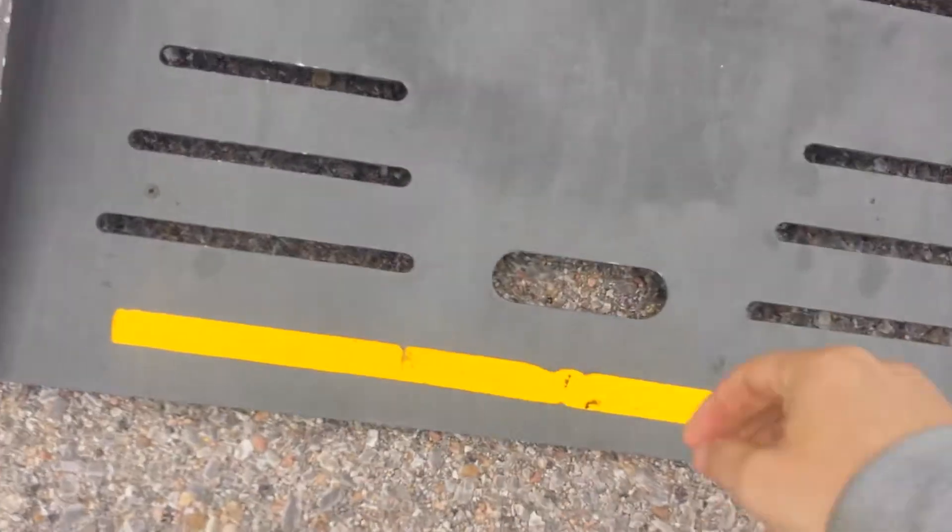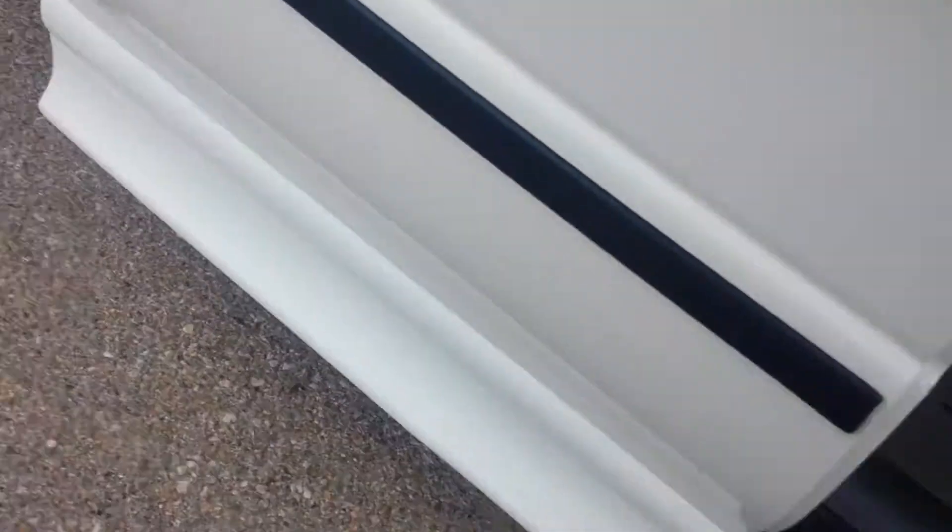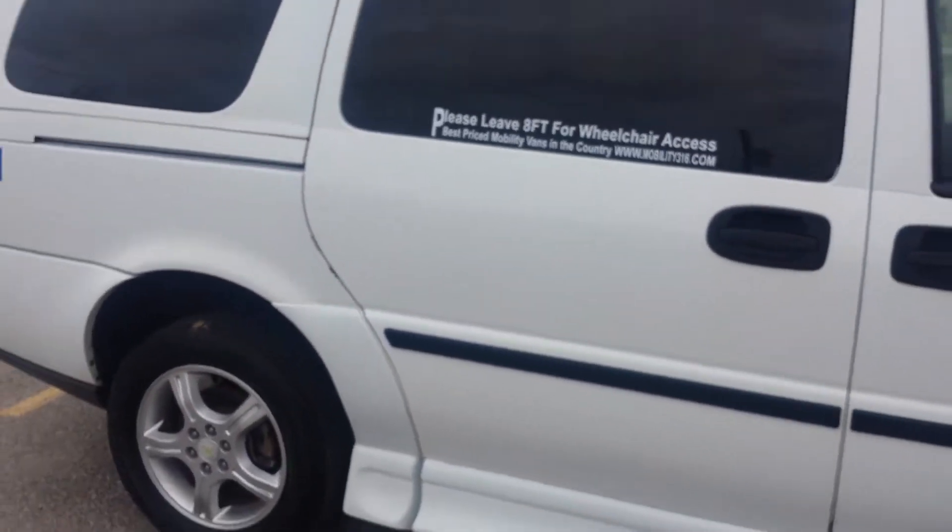When you've got all your passengers secured, come back over, grab the ramp, reverse the process — it folds right back up, really easy. Grab the sliding door, shut her down, and you're ready to go.